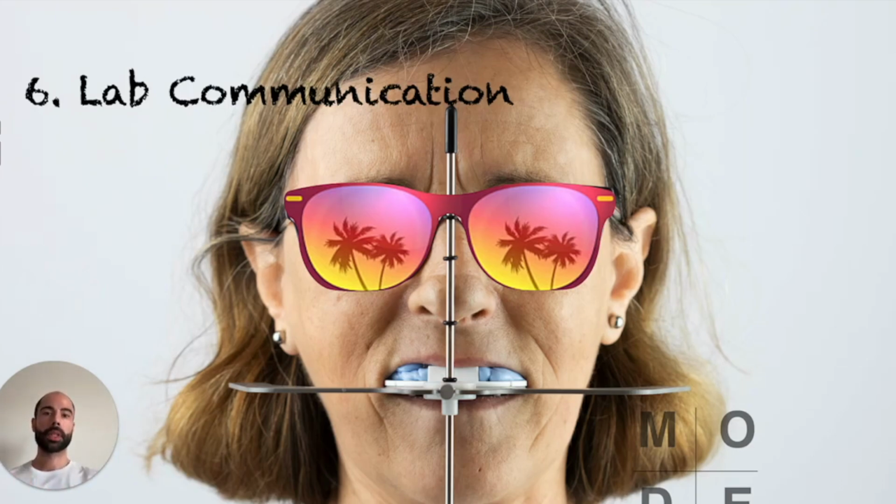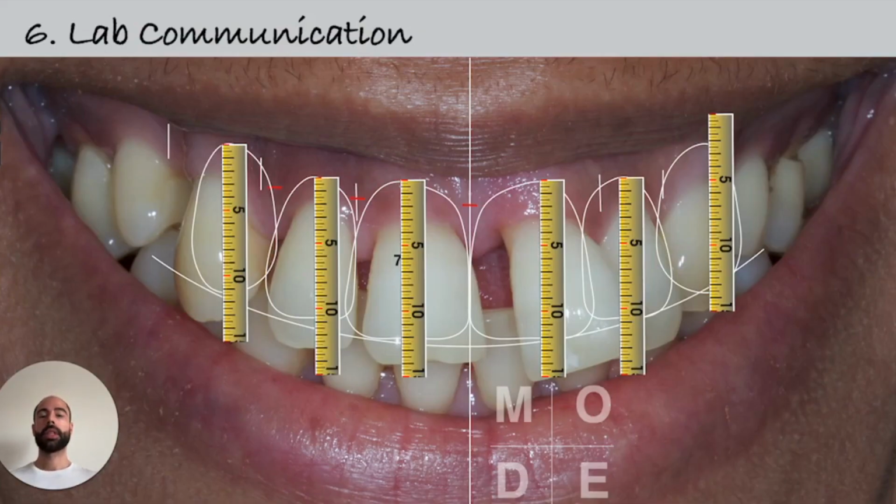This is a very important step, not only for full arch cases, but also for aesthetic cases. And of course, in the back office, after your first appointment, you may want to do some basic DSD to help guide your lab during the wax-up, or maybe you can go one step further and do the full DSD design to show your patient your final result.